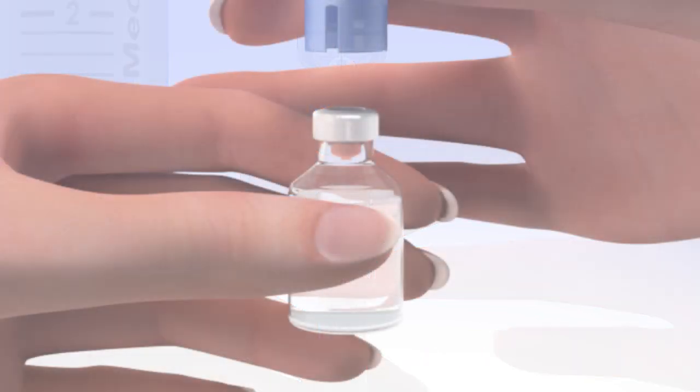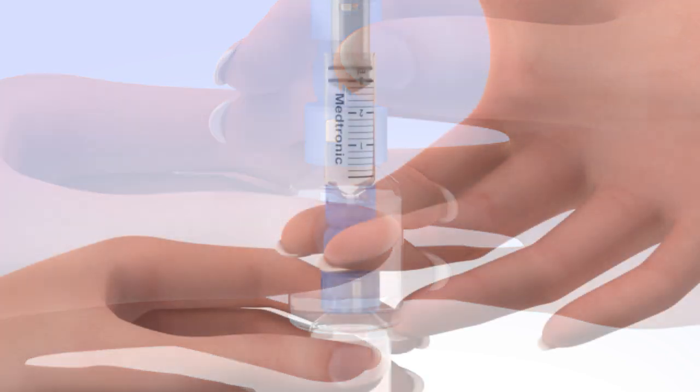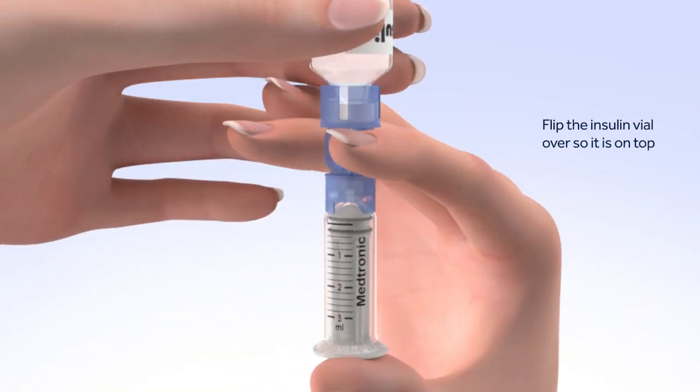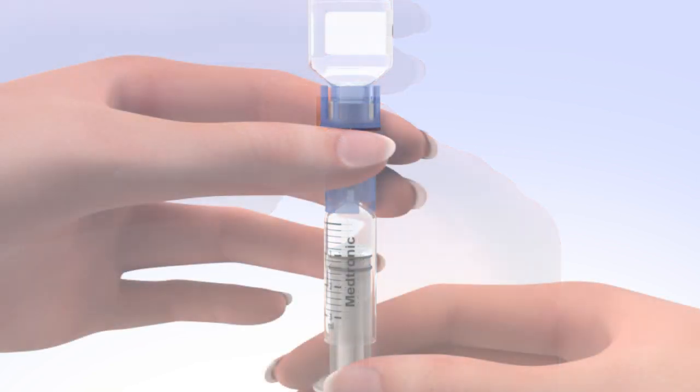Hold the reservoir by the blue transfer guard and connect it to the insulin vial by pressing down. Be careful not to push down on the plunger during this step. It's very important to push air into the vial before taking insulin out. To do this, keep the insulin vial upright, place your thumb on the plunger, and firmly push the air from the reservoir into the insulin vial. Continue to hold down the plunger with your thumb, then flip the insulin vial over so it is on top, making sure you are holding the vial with your other hand. Slowly release your thumb pressure from the plunger rod and the reservoir will start filling with insulin. When the reservoir stops filling, slowly pull down on the plunger until the top black o-ring lines up with the desired amount.